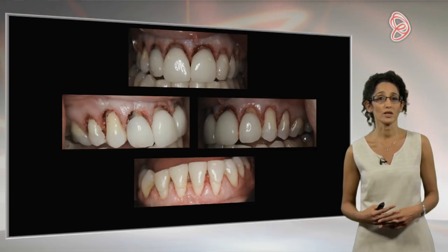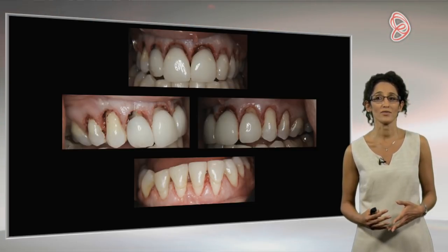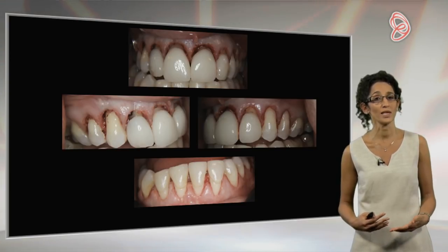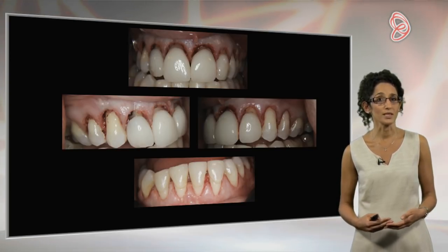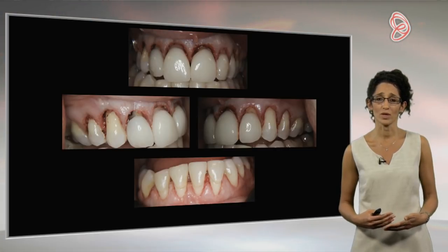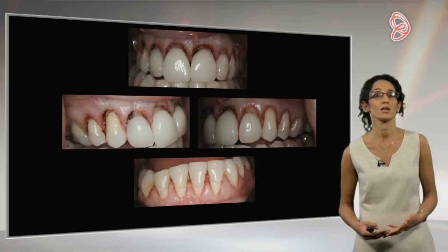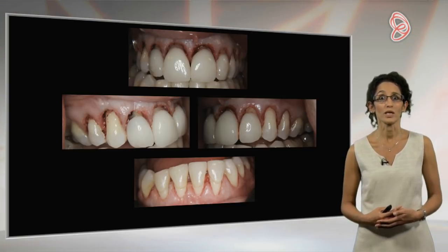Going to the middle of the slide, you can see the right and the left, how we've reshaped it. And this is after bone removal, which is why you can see a little bit more bleeding, because we will get some bleeding of the bone even though we're using lasers. And of course that's exactly what I want. I don't want to fry the bone and risk necrosis. So that's also really, really important.